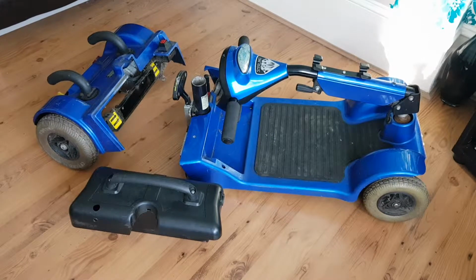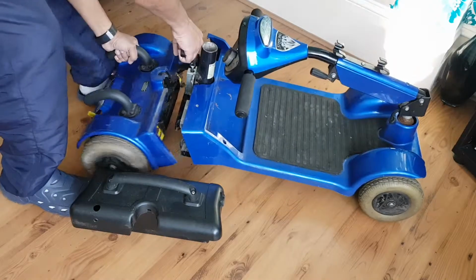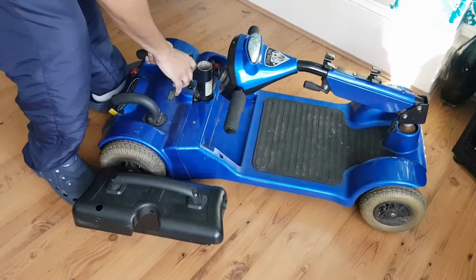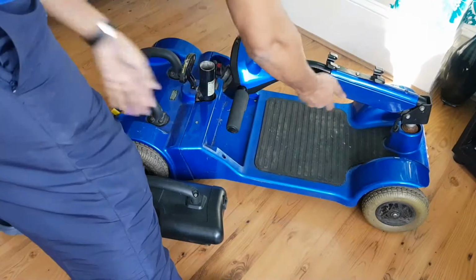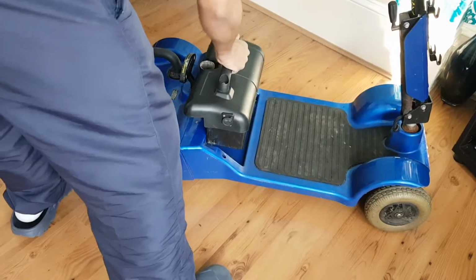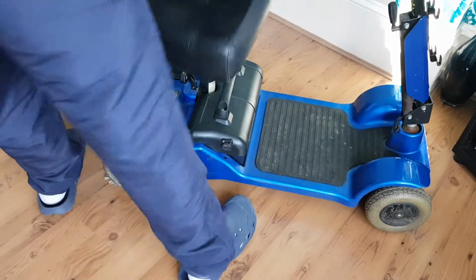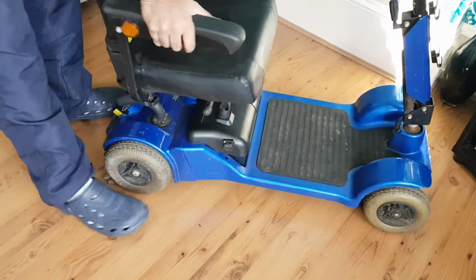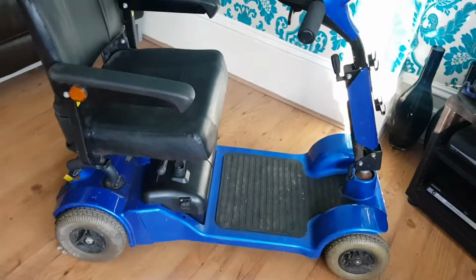Let me put it back together for you guys. Okay, so I'll get this back to the slot. Done. Easy, right? Let's get this lever back up. Battery's in. The chair. Good. And then, there you go.